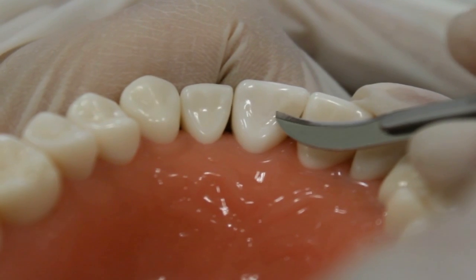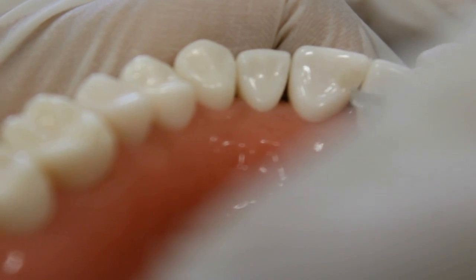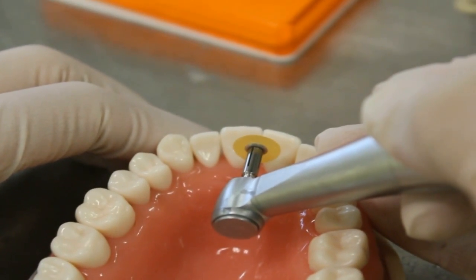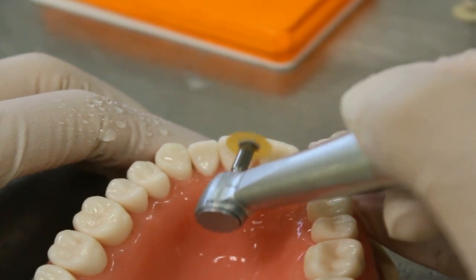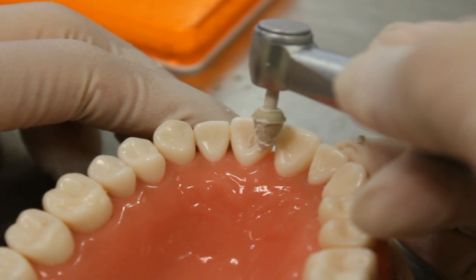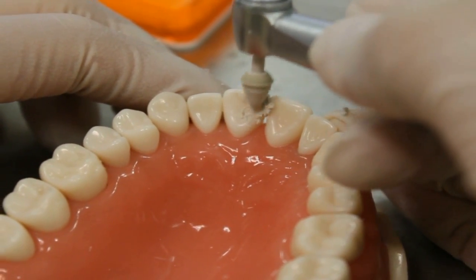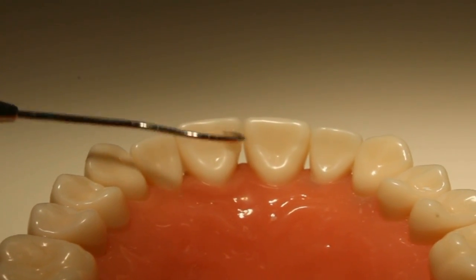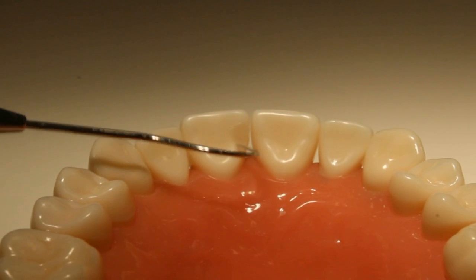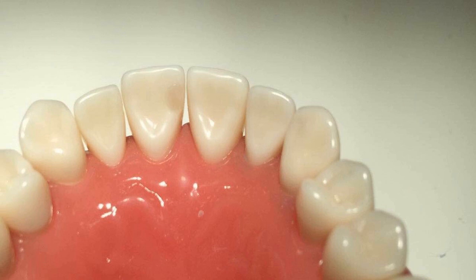I prefer to start with the scaler to remove the gross excess, then move to the finishing disc. Be careful not to damage the adjacent tooth or the restoration itself. Polish with the rubber polishing point and polishing paste. Finally, with the explorer, check any excess at the margin — it should be continuous with the tooth. And this is how it looks like when finished.